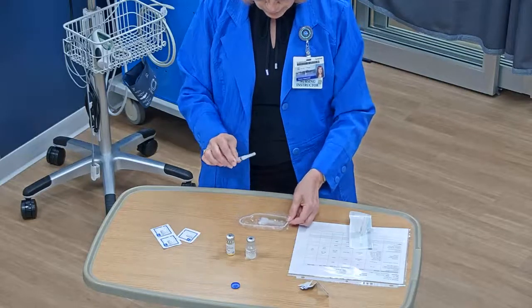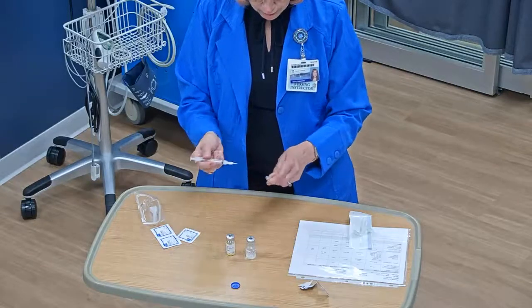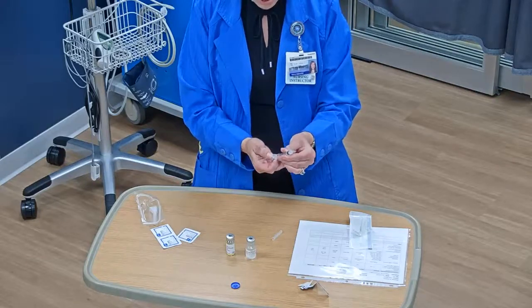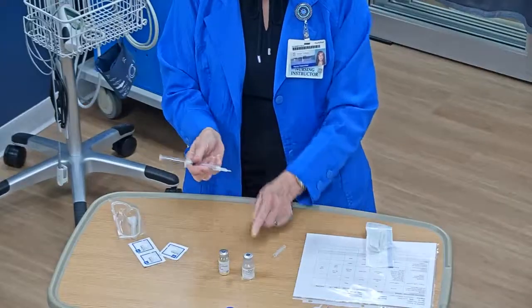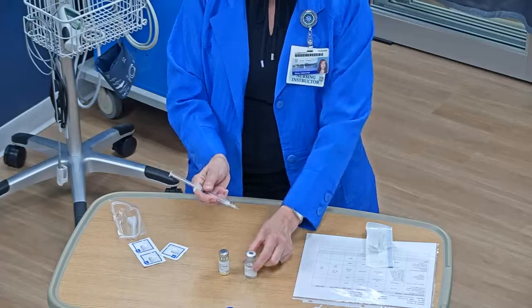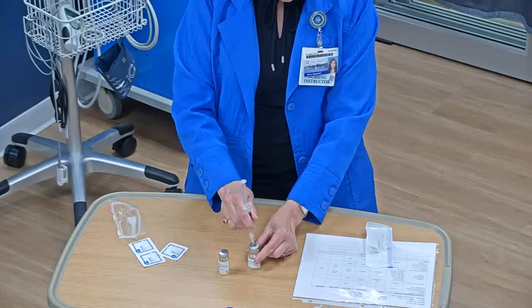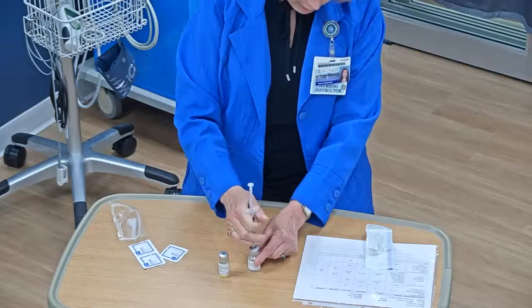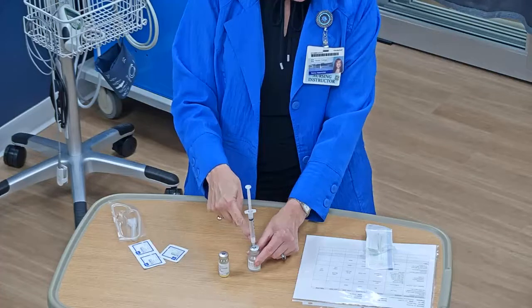I set my needle to the side for right now. My first step is to draw up — take the cap off here — draw up 2.8 milliliters of air. Then I have to put the air into the diluent vial so that I can draw up the 2.8 milliliters of liquid. To access the vial, I start at a little bit of an angle and then go straight in, and you have to push really hard. It makes a pop noise once the vial access device actually gets through the stopper.